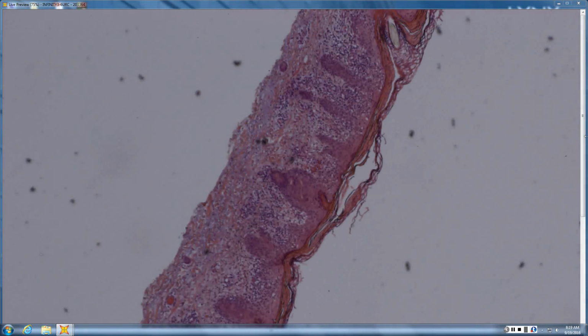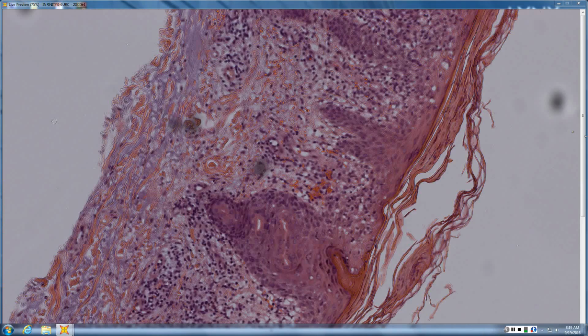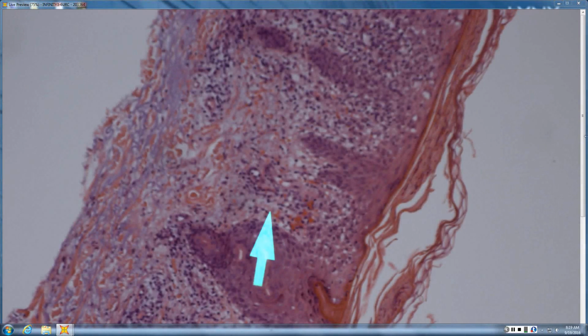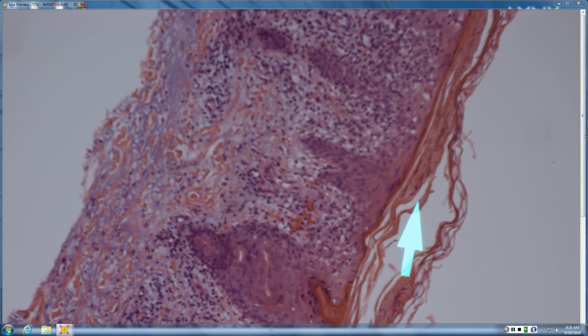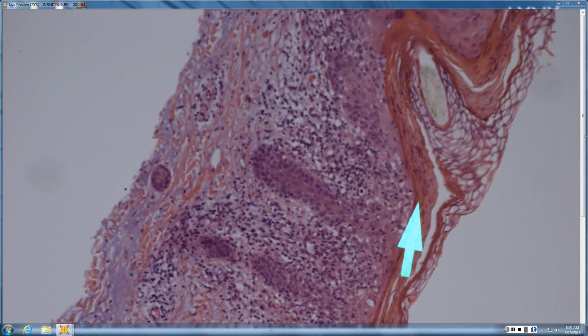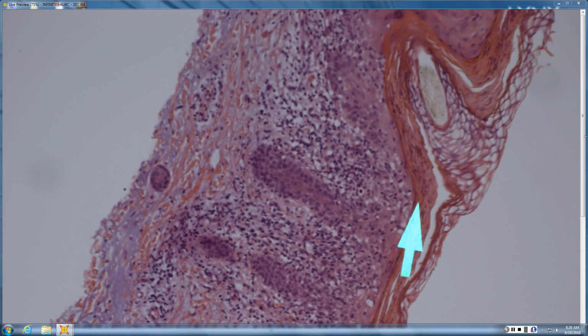I don't see any sawtoothing. Don't see any sawtoothing, so then you'd say more vacuolar. Looks like dead red. Those are erythrocytes. Oh, okay. So I would think PLEVA or PLC. And I see a scale crust, kind of a dirty scale crust with neutrophils. So is that PLC? It's PLEVA? PLEVA. Okay.